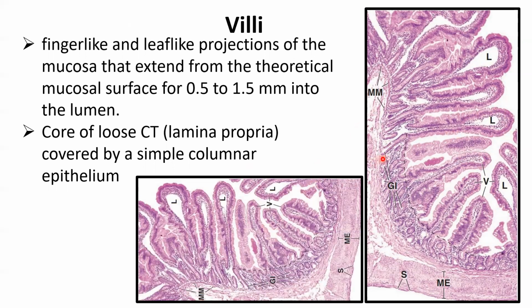Again, this is the same image I just flipped. And that's why you need to know exactly how the epithelium looks like, whether we put the image like this or like this. It's not right and left, it's not up and down, it is where the epithelium is. So this is important. You don't get confused by looking at the slide, it was a different orientation than what you look at. If you know how the epithelium looks like, you should identify the epithelium no matter where it is.